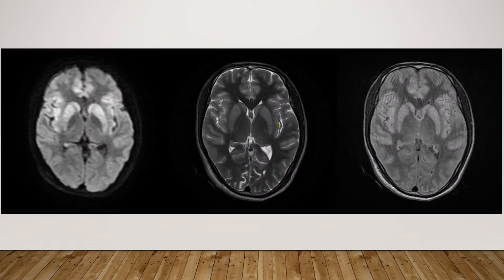Here are the key images. On this T2 weighted image we can see that there are hyperintense signals in bilateral lentiform as well as caudate nuclei. These findings are confirmed on the FLAIR images, and besides that there are hyperintense signals in the bilateral cerebral cortex, especially the insular cortex, which are showing restricted diffusion on the diffusion weighted imaging.